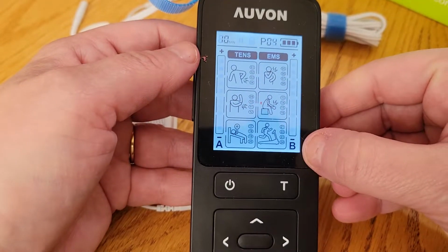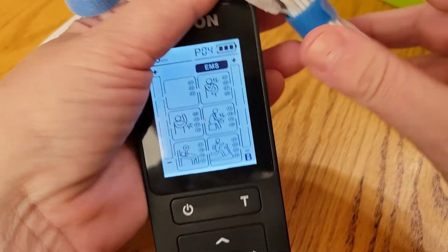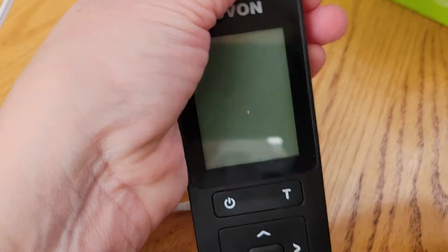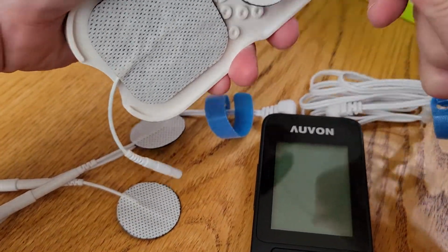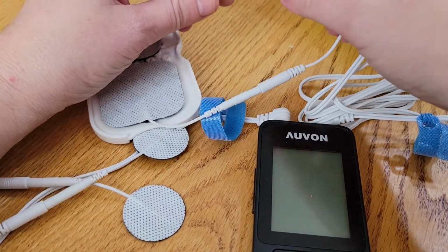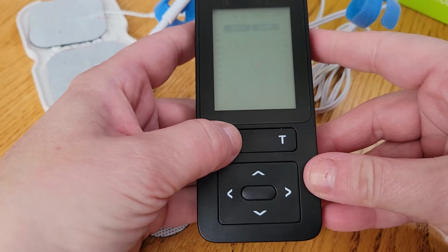Now, let's say you wanted to use B over here also, which is adding more of these. So you plug that in. I'll shut this off here in the meantime. And there's the power button right there. I'll unhatch those. And on this one, I'm going to use some of the square pads. And I'm just going to plug those in again. This is how you would work 2 separate muscle groups at the same time, having channel A and channel B both in the outputs. Like I said, these are a little bit lower profile up here. Go ahead and hit the power button.